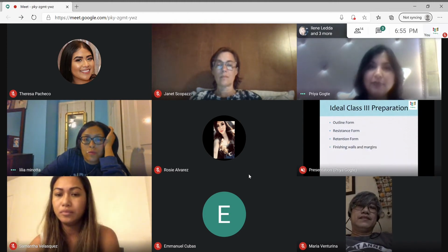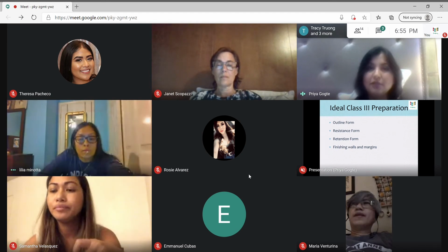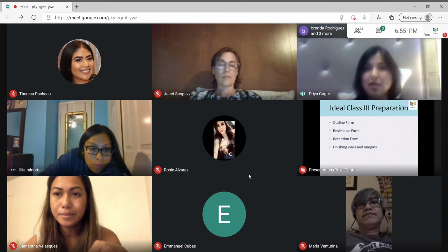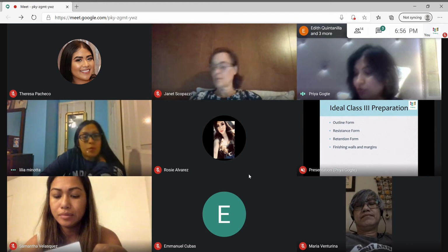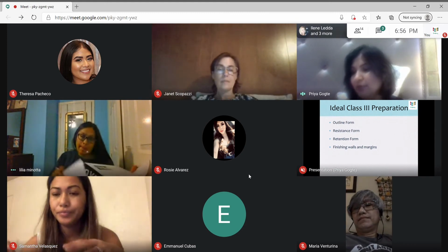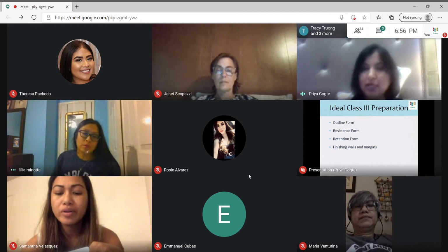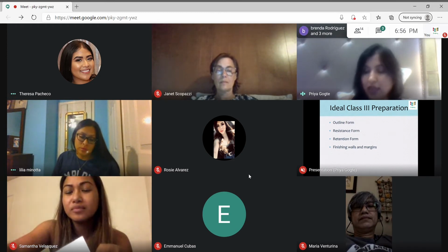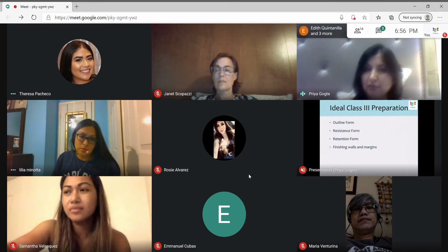So now when we are doing a class 3 preparation, there are lots of things we have to keep in mind. I'm going to go through this pretty fast because you guys are not going to do it, but I'm going to ask a few questions just to see if you have understood the material. When you're doing a class 3 prep, after it's completed, does it look like a square, a rectangle, or a concave? How does it look? Can somebody let me know?